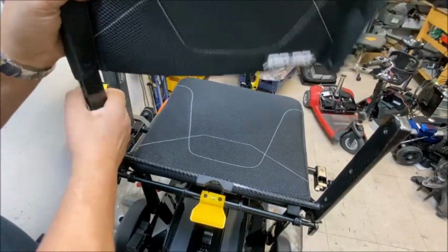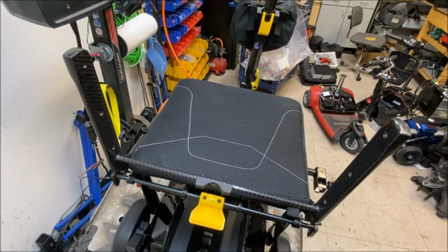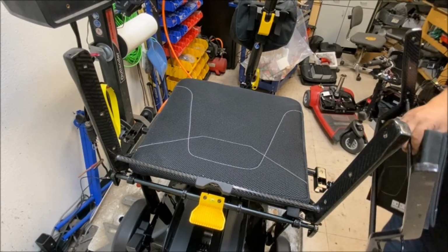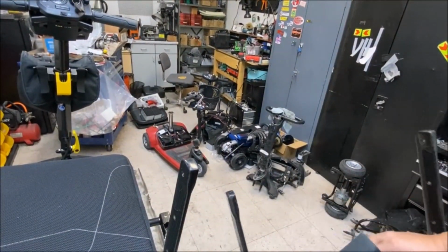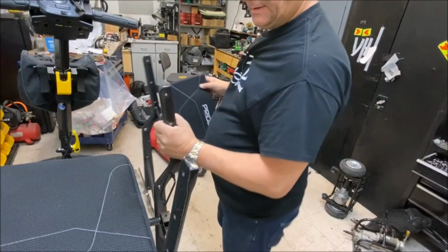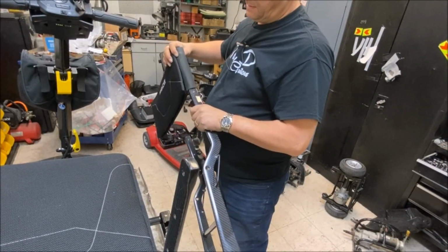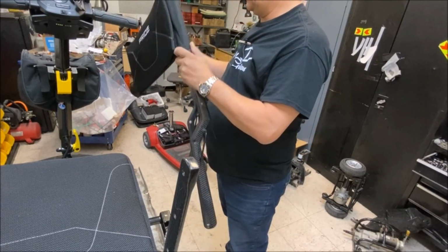So what I'm doing here on the video is just taking the backrest off, and I'm going to put that onto the new support frame, the carbon fibre support frame. So I'll do one bit at a time, so I don't get lost. I know which way round everything goes and where the screws go and everything, because I've never done one of these before. So do it a little bit at a time.